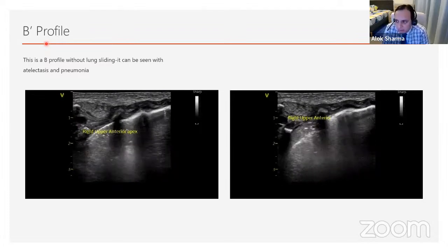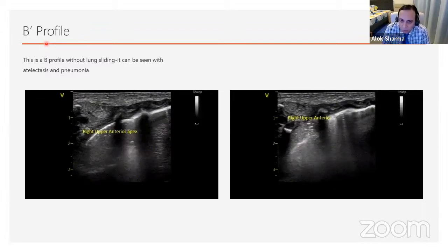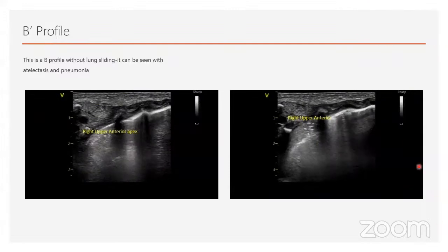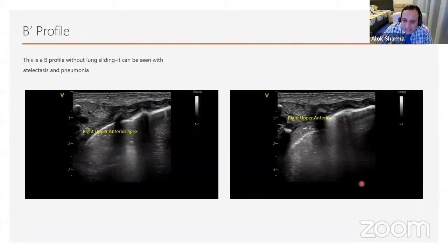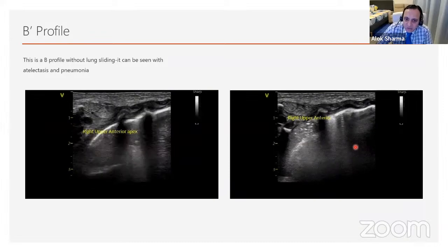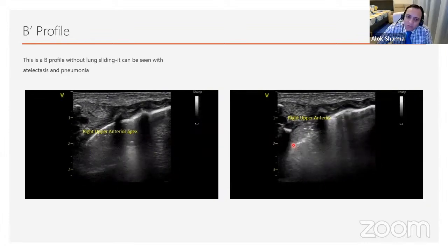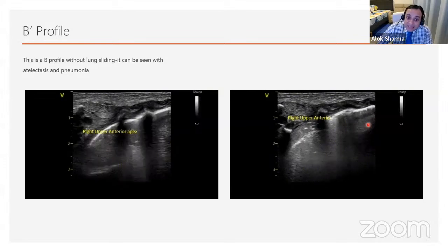So subpleural consolidations, which you see that are minute and are below the pleural margin in RDS, they're also consolidations. Yes, a deep consolidation is also a consolidation. What it reflects is an area of lung that is less well aerated, possibly because there's fluid in it, because there's exudate in it, or as in hyaline membrane disease, there's a hyaline membrane which is preventing aeration of the subpleural area of the lung. But air can still get in and out.